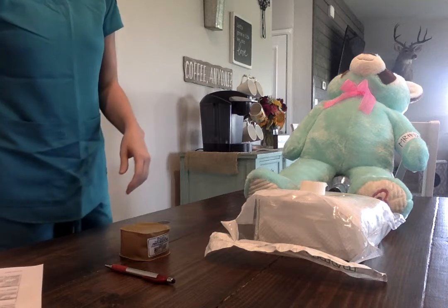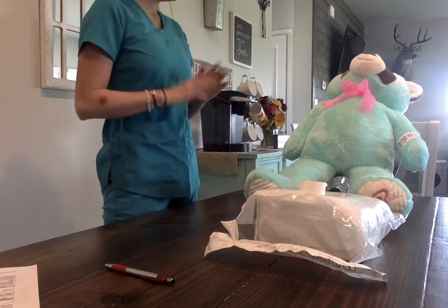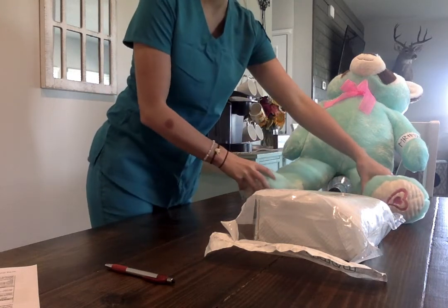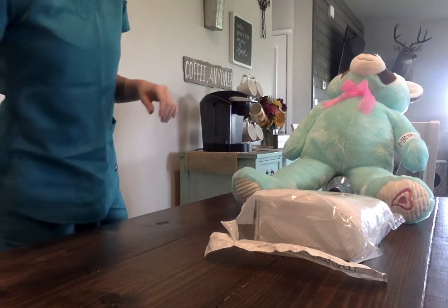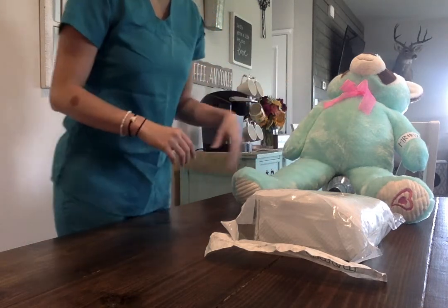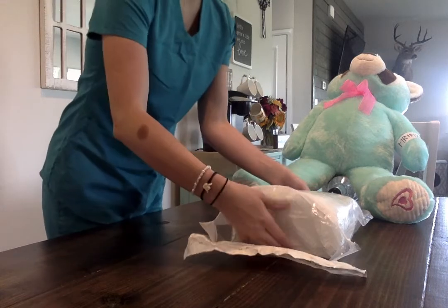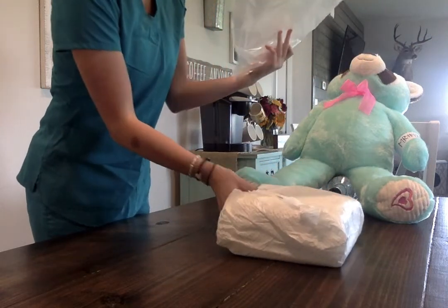Alrighty. So now I'm going to insert your Foley catheter. I'm going to make sure that you're in a good dorsal recumbent position with your knees bent. Let's get that out of the way. Okay, and I'm going to lay a pad down, and pericare has been performed. And I'm going to wash my hands after giving you your meds, of course. But I'm going to just go ahead and set up my sterile field here.